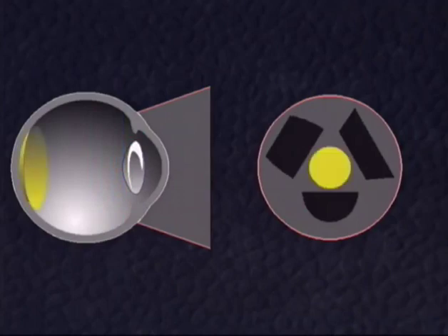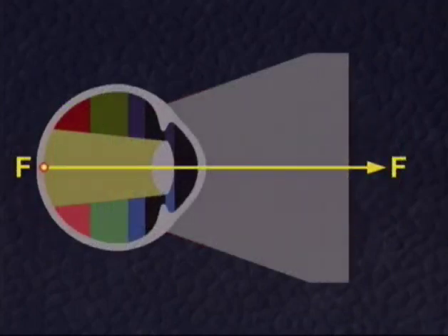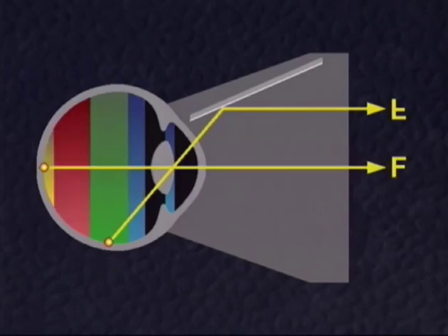All mirror contact glasses, however, have an inconvenience. Only those parts around the axis of the eye are seen directly, but the peripheral parts can be seen only inverted by the mirrors. The complete image of the eye interior, therefore, must be combined in the examiner's mind from direct and inverted components, but this is easily mastered with practice.